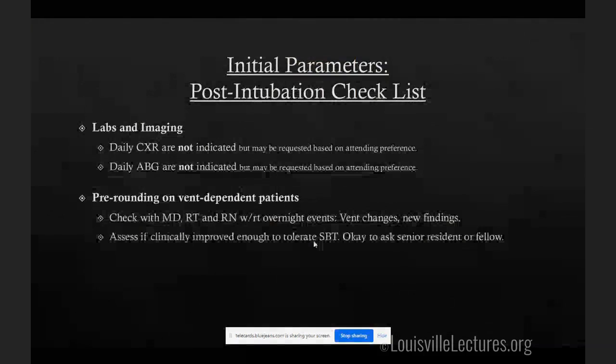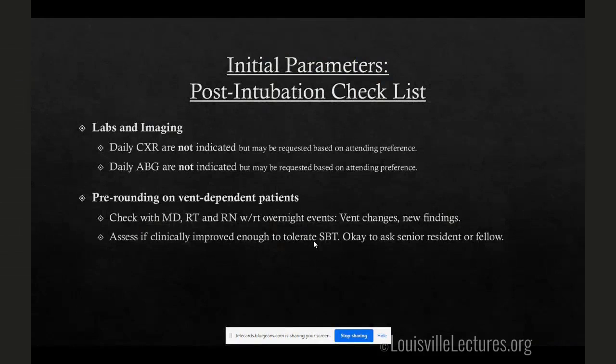So I've told you a lot about what to do, but what about daily x-rays and daily ABGs? They're not routinely indicated, is the long story of it. Now, you will notice this little disclaimer here is that it depends on your attending as well. So if the attending wants it, or just better off just getting it.